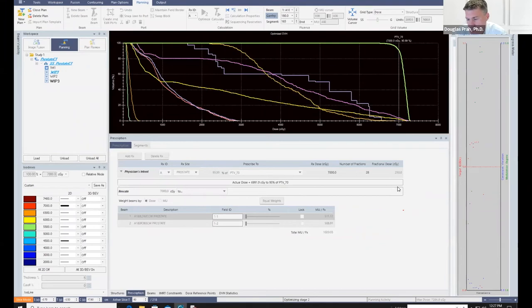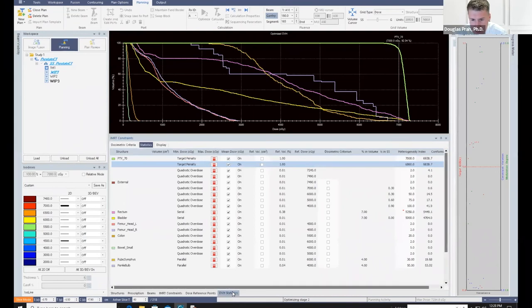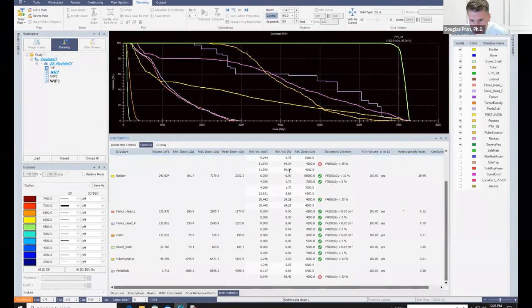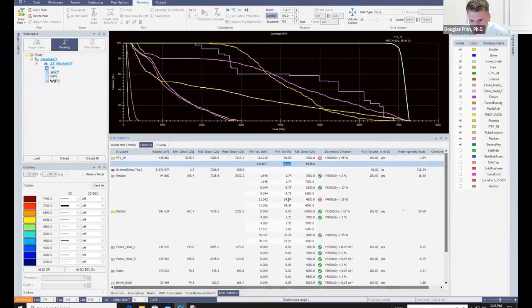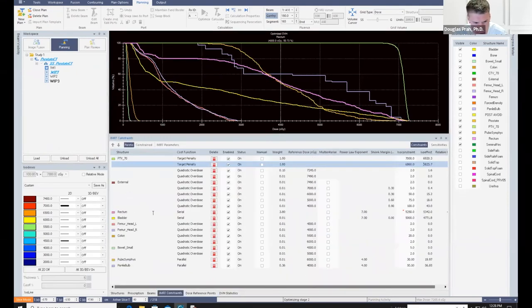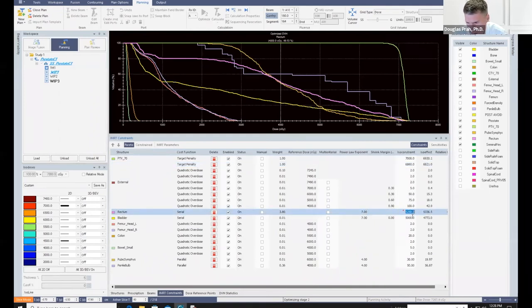Well, I'm glad I'm rerunning this. This is coming together a lot more quickly now, and we can take a look at these stats. So there's a couple of things it's still struggling with. It looks like the rectum, the high doses still need to come down, but it's still optimizing here. So this is getting close, and my 35% less than this is off a little bit. So normally, but this isn't surprising. If you remember, we decreased this number quite a bit. So let's drop this back down and let the optimizer push a little harder.